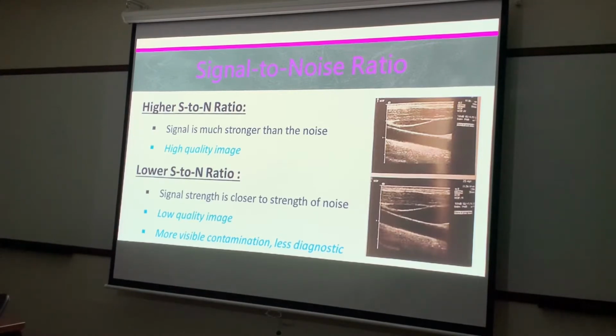No, not concerning bioeffects. Noise is what happens when a signal comes back very, very weak. If we have a really low signal, it's not giving us good information, but I can't turn my gain down or turn my output power down low enough to get rid of it. It's still going to be there.